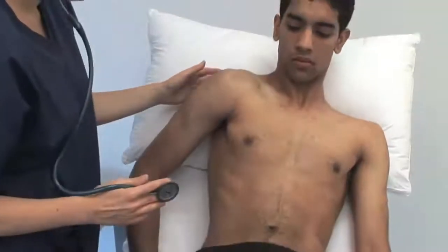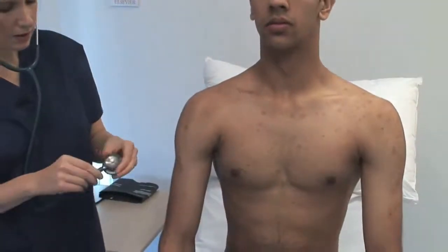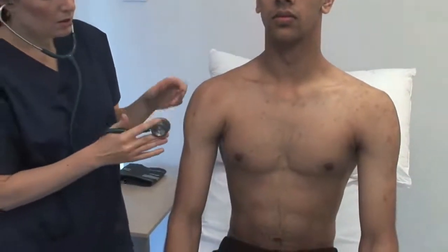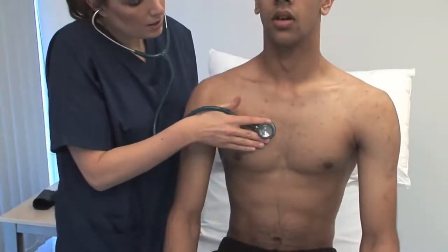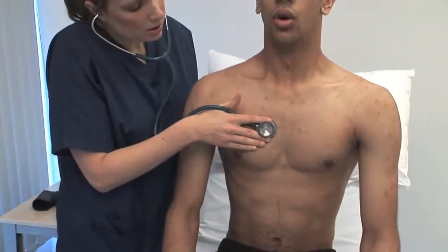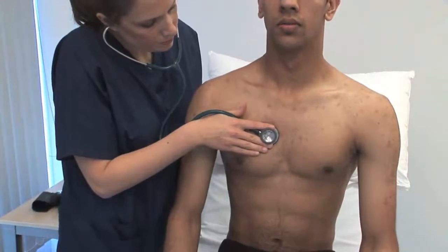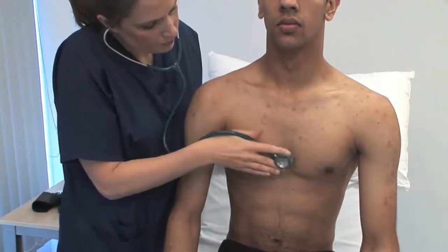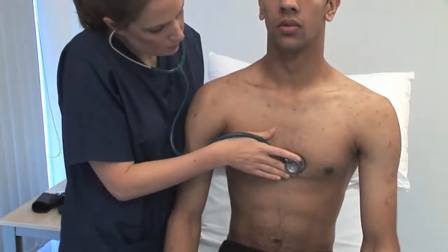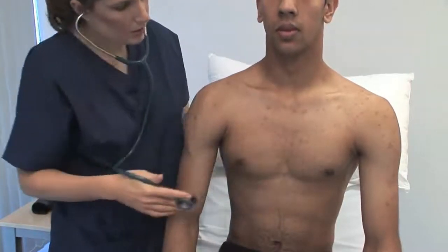Please could you sit forward for me. With the patient leaning forward, listen in held expiration. Take a deep breath in and out and hold. For the murmur of aortic regurgitation, best heard at the left sternal edge in the third or fourth intercostal space.